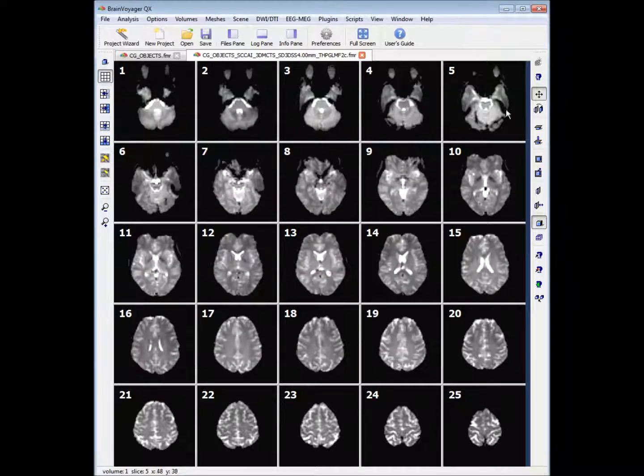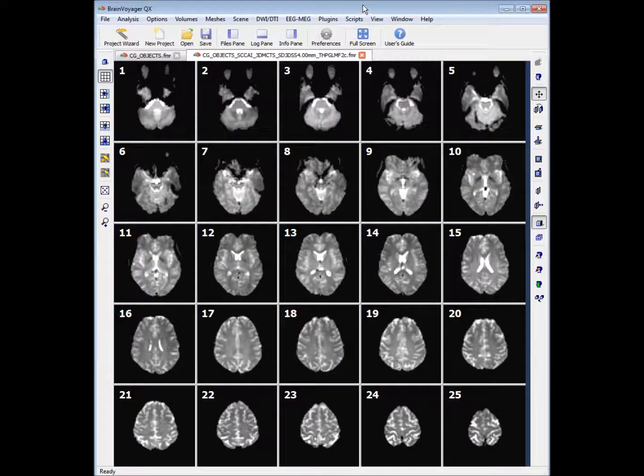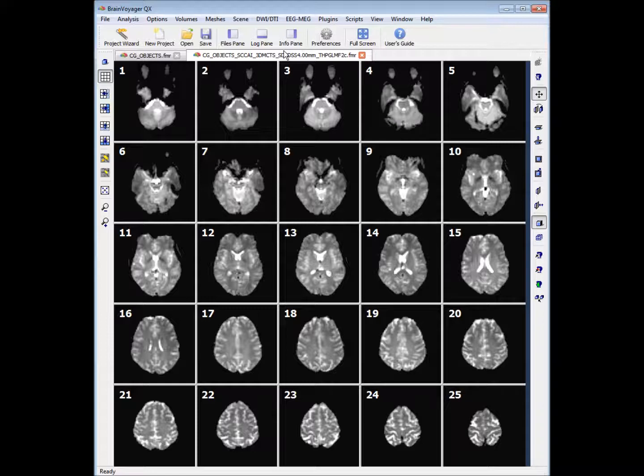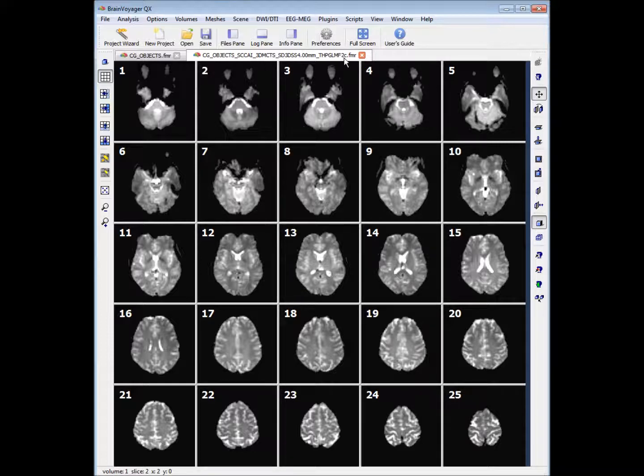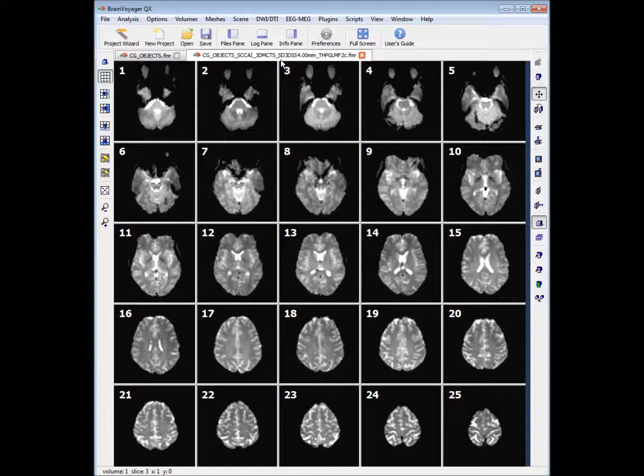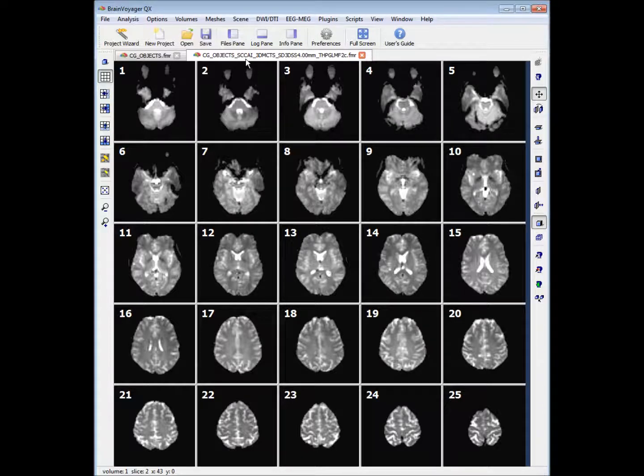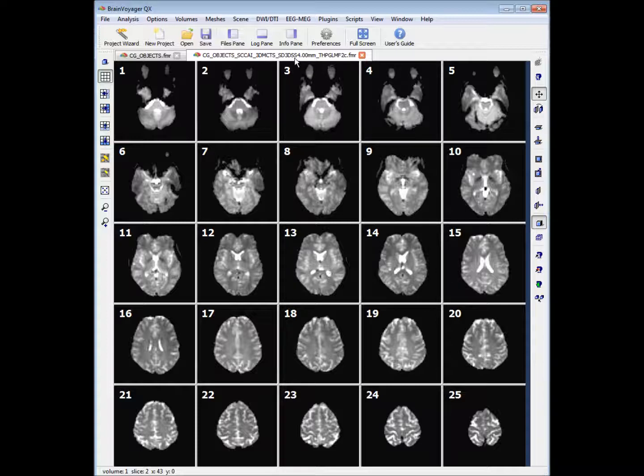So we can close this window and what you'll find is Brain Voyager has automatically saved the pre-processing steps as this file with a very long extension. The extension just refers to the pre-processing steps that have been applied to your data. For example, slice scan time correction, 3D motion correction, space domain spatial smoothing, and temporal high-pass two-cycle filter.